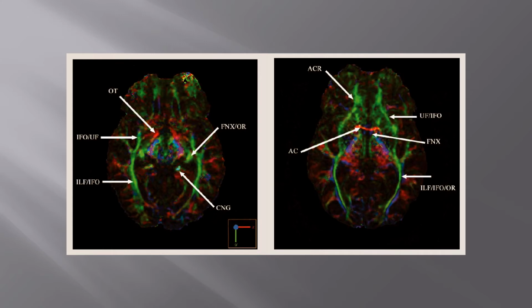Here are fractional anisotropy maps that are color encoded to direction. So fractional anisotropy basically tells you about the integrity, the directionality basically, of areas of white matter. And in the brain, that then reflects on the simple color coding in the different white matter tracts. So here you have some optic tract coming back to the lateral geniculate, which then goes into the optic radiation.